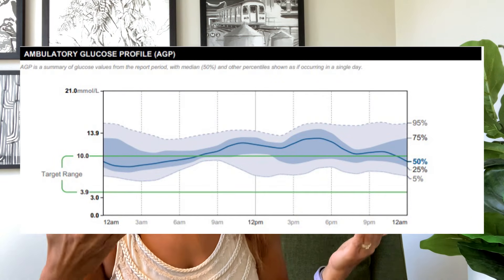That was just the first page. If you need to focus, I'd suggest looking at your average glucose, variability, time in range, GMI, and the overview graph. Remember, to get the most accurate GMI you need more than 14 days of data — preferably 90 days. It won't necessarily match your A1C exactly, but the more data you have, the better the indicator. When I look at the overview graph I immediately zoom in on 9 a.m. to 7 p.m., where blood sugars are higher, and I see a mid-morning rise as well as an afternoon rise.